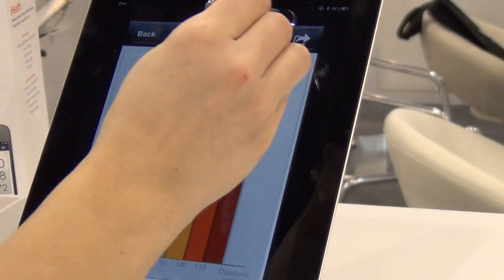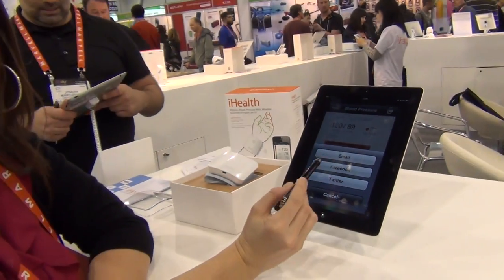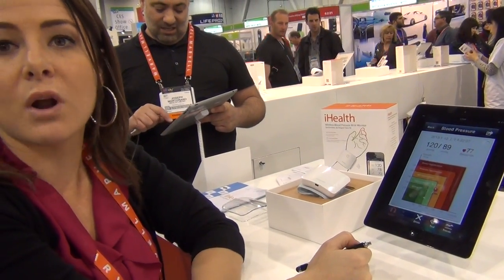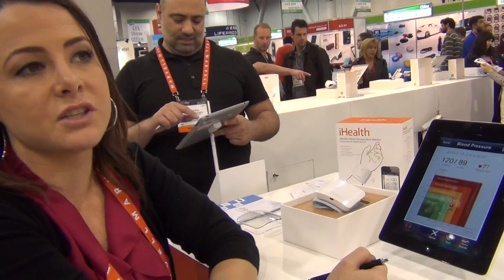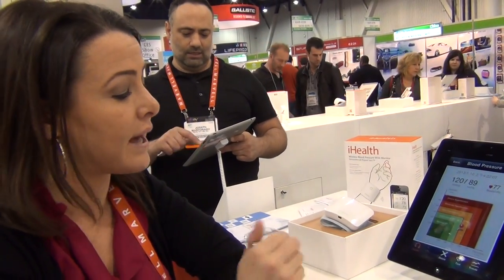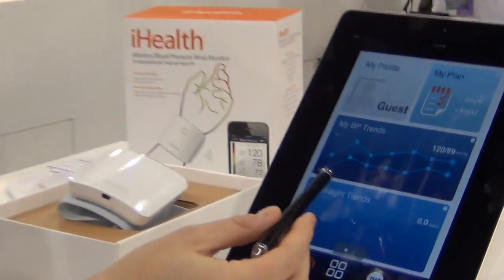Cool things I can do with this app: I can actually share these results through Facebook, email, or Twitter. I also can send a CSV file — raw data. So if my physician is asking for all of my blood pressure results in a data format, I can send them that as well. Our app right here is really a health management tool.